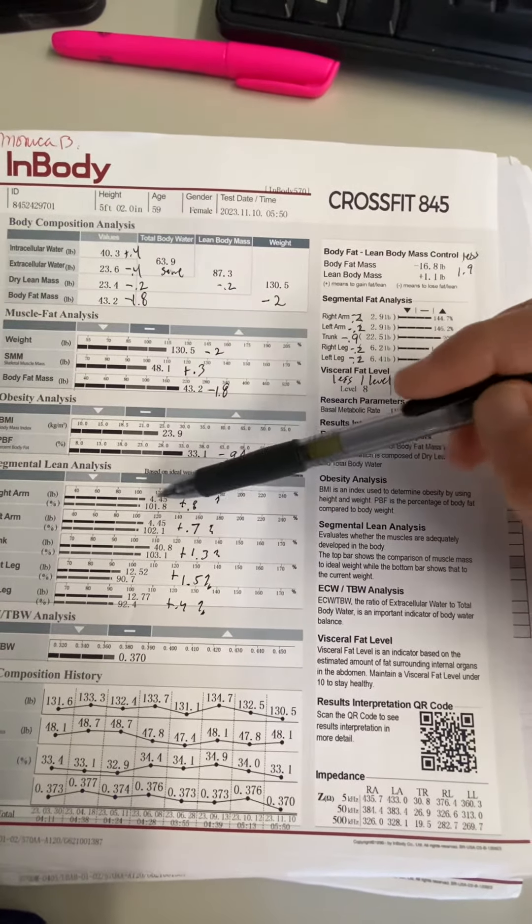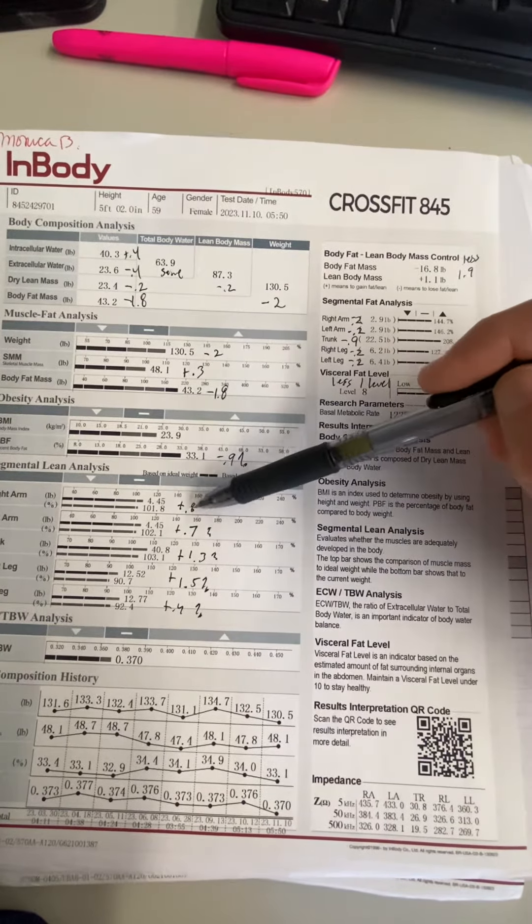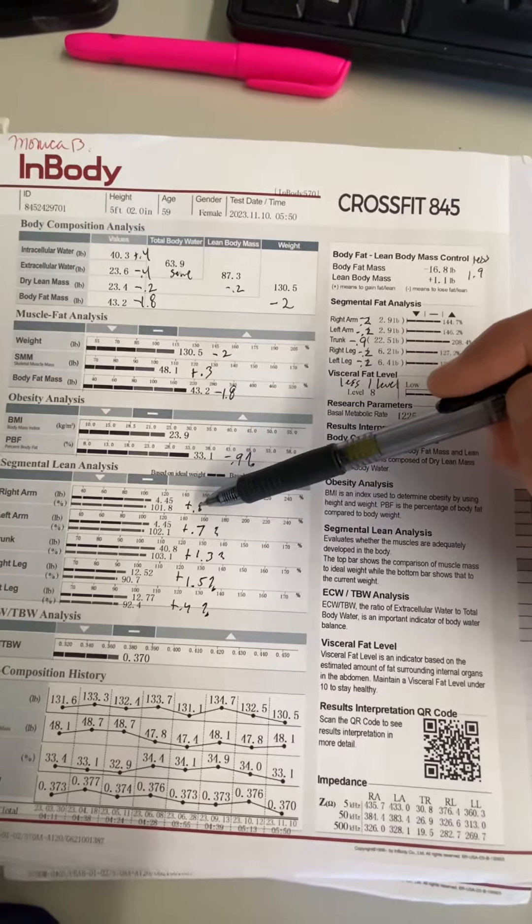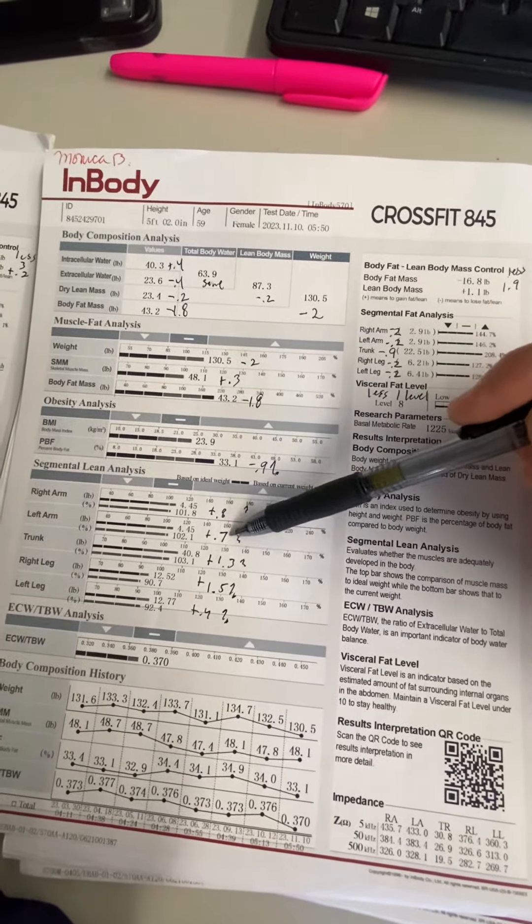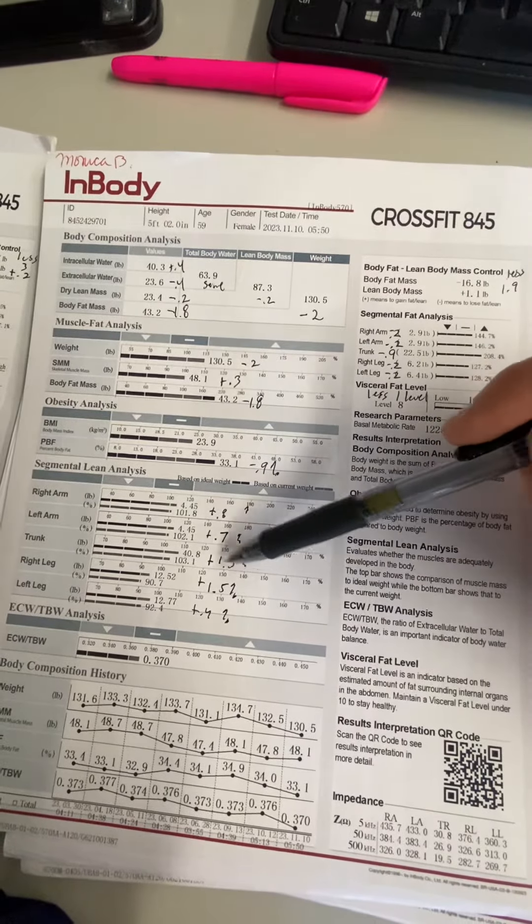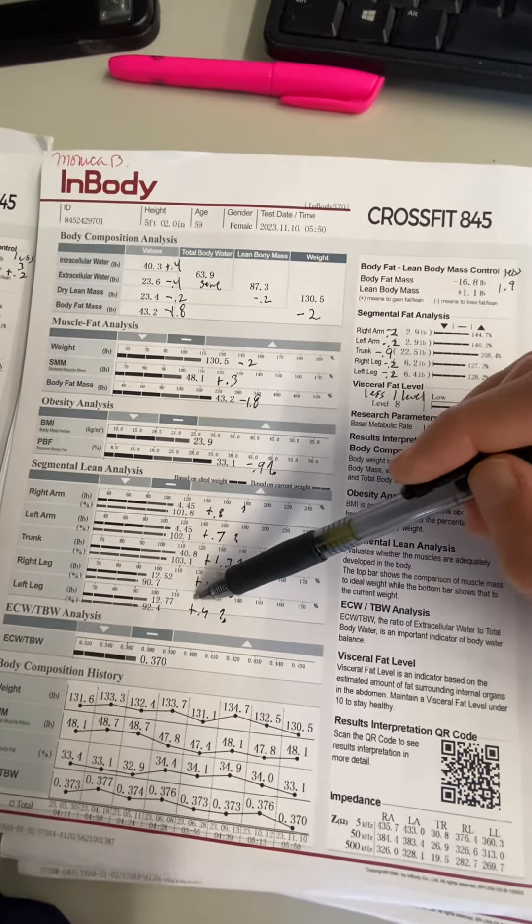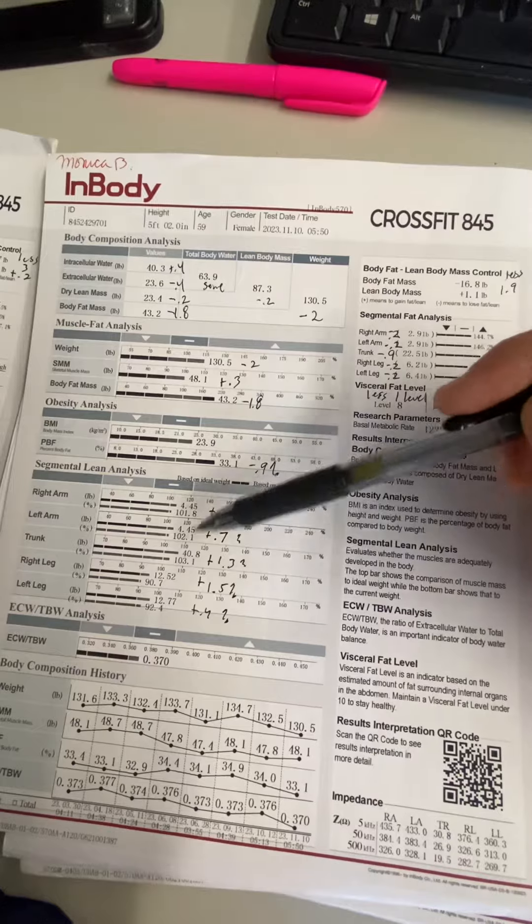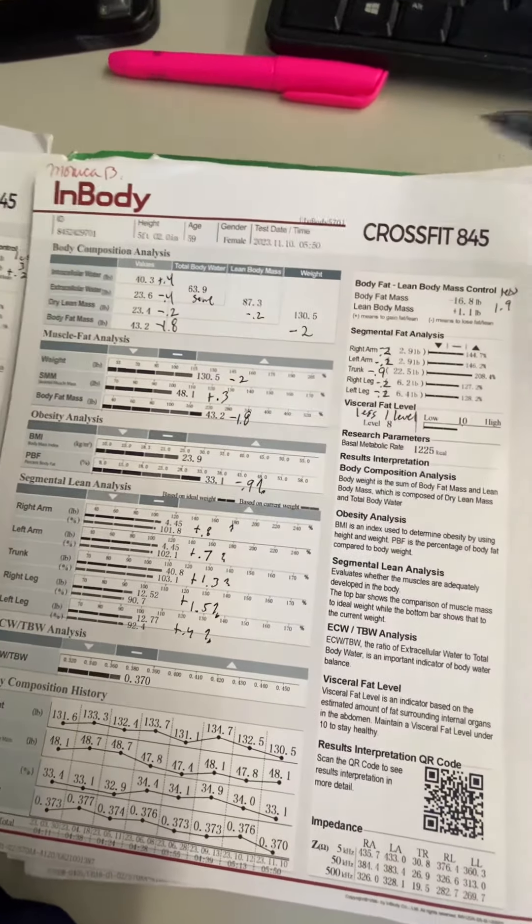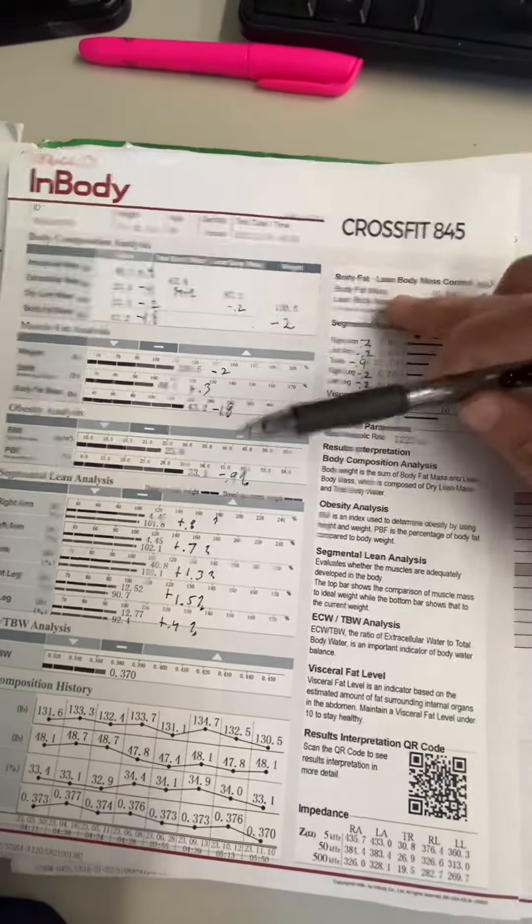And then - I love seeing all areas of your body increasing their ability to support your body weight. Your right arm 0.8, left arm 0.7, trunk 1.3%, your right leg 1.5%, and your left leg 0.4%. All of that, especially for you - a lot of times we'll see those things dip down - went up, which is great.